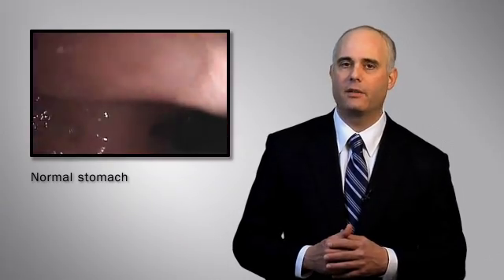Like other endoscopes, it's a long flexible tube with a light on the end and a TV camera. This allows the doctor to do a visual inspection of the inside of the GI tract.